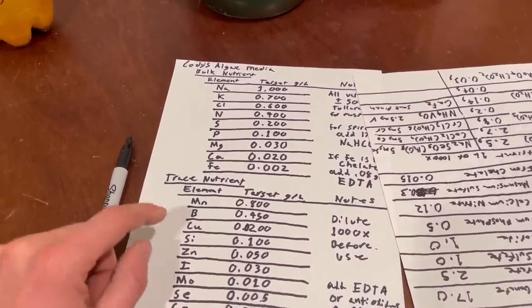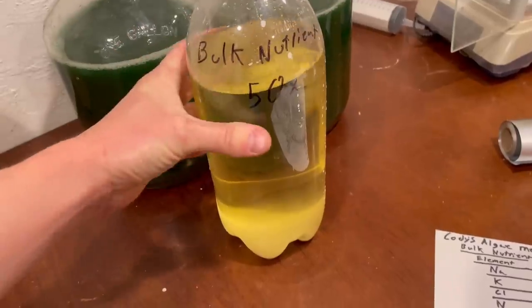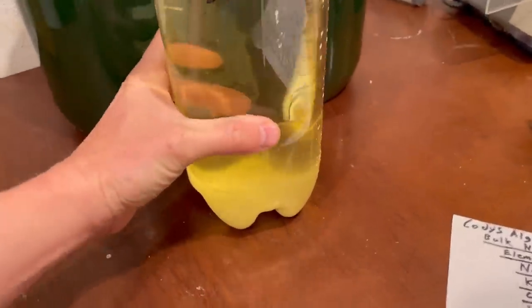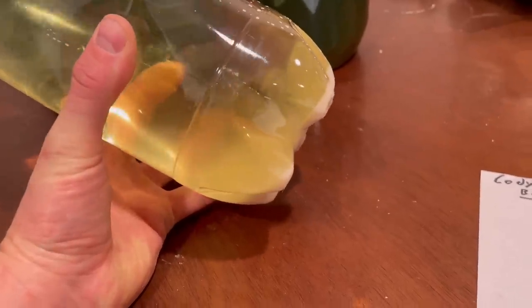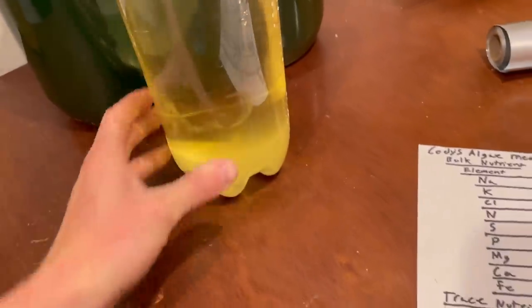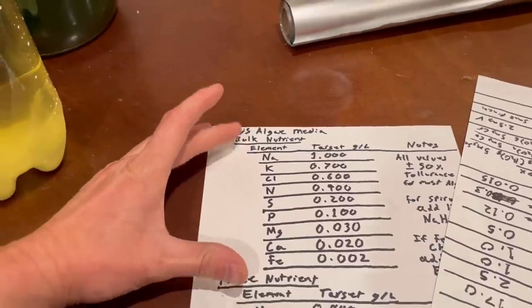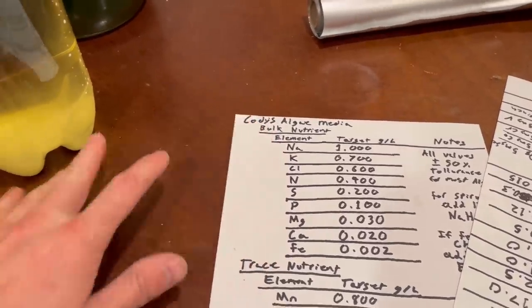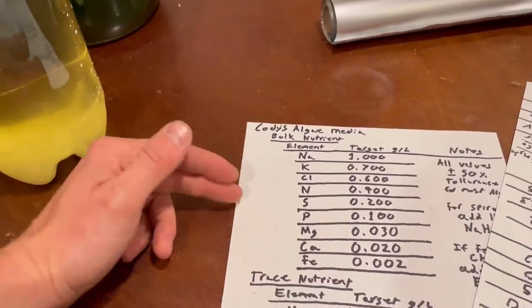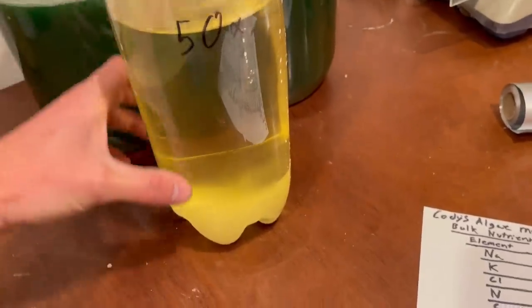It's one of those things where it is necessary for life — life cannot exist without copper — but too much is toxic. While I'm at it, I'm also going to redo the bulk nutrient solution. A lot of my nutrients have settled out on the bottom. You can see this white precipitate — that is mostly calcium sulfate and magnesium phosphate — stuff which has low solubility at this concentration. When diluted for the algae media, those are soluble enough to dissolve, but concentrated like this, most of them settle out.